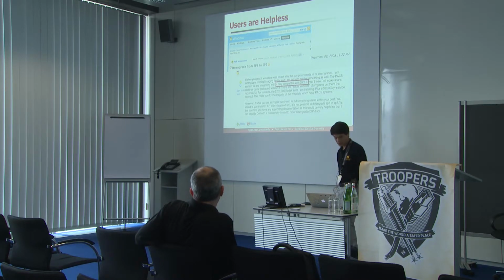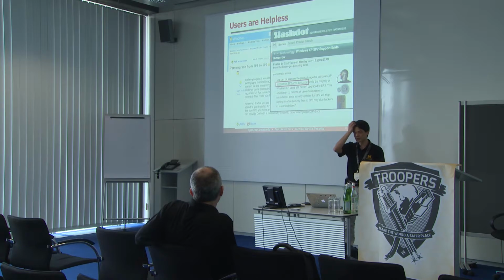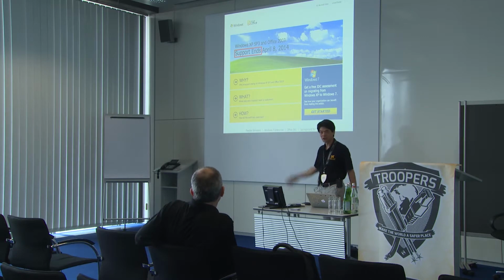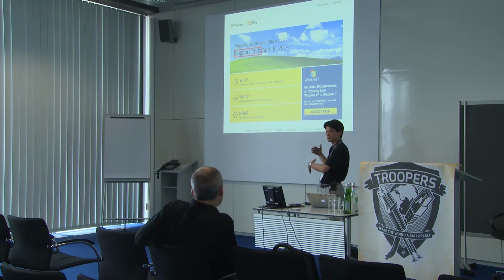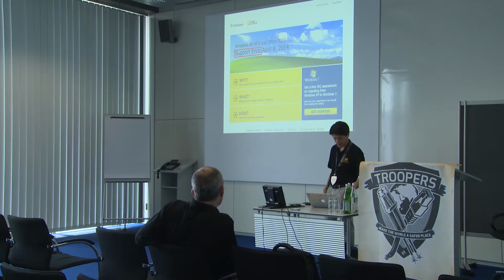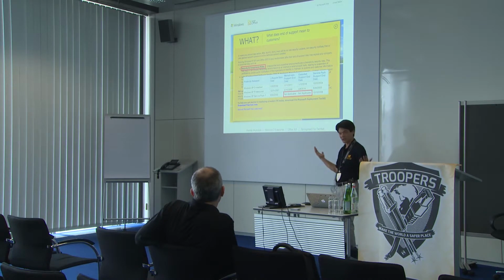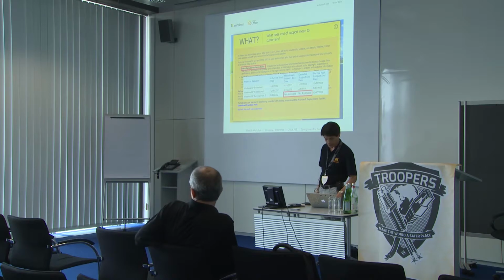So you downgrade to Service Pack 2, but then when you put your security hat on, you're like, oh, wait a minute. Service Pack 2 ended years ago. Microsoft doesn't support it anymore. And moreover, Windows XP in general goes off support on April 8th of this year. So there are still products in development that are going to be using Windows XP, and yet its software lifecycle is just completely incompatible with what one would expect in clinical care. It brings up all sorts of security and compliance risks. Some of the software is so old that Microsoft doesn't even have dates anymore. It's just amazing the difference in software life cycles used in general IT versus in the medical device community.